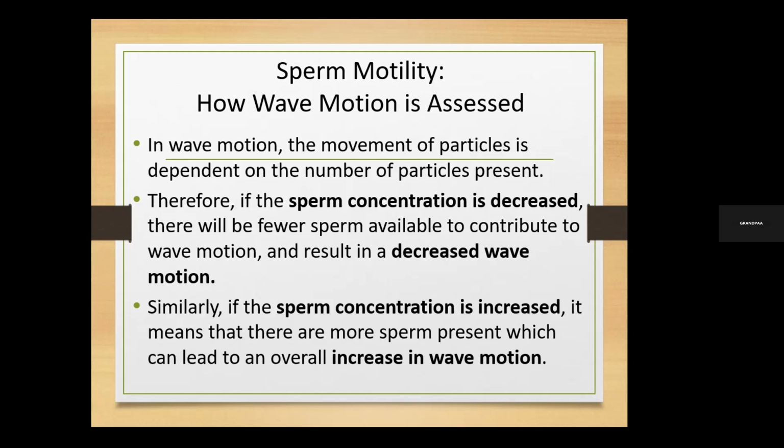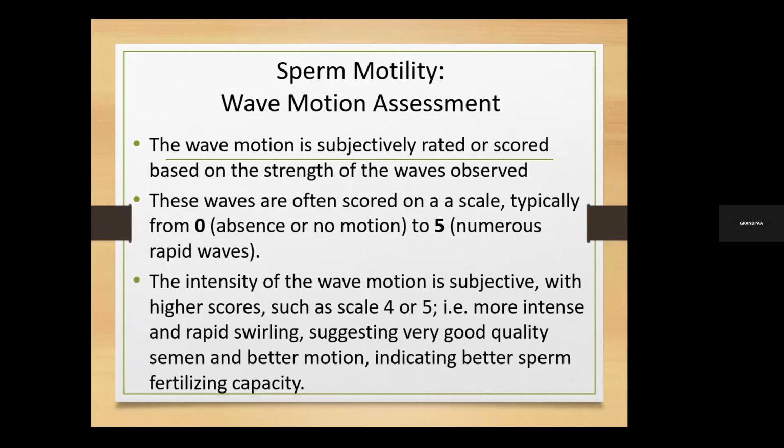That is something that, if you do labs, it just gives you. It could be theoretical, but it's also something that you can practice. Once you do it all the time, anytime you get a sample, that's the first thing you do. Once the sample has liquefied, you do it. So it gives you a fair idea about what to expect.